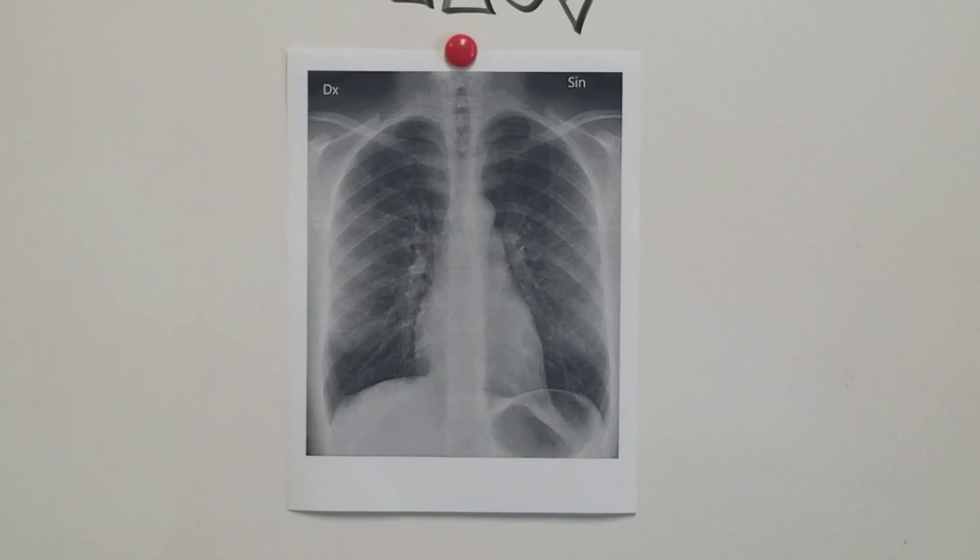Hey, Med School Made Easy. Today we're going to talk about how to read a chest x-ray. There are a lot of different ways to do this. This is the way that I find to be the most easy, and it's a mnemonic, which we love in Med School Made Easy.